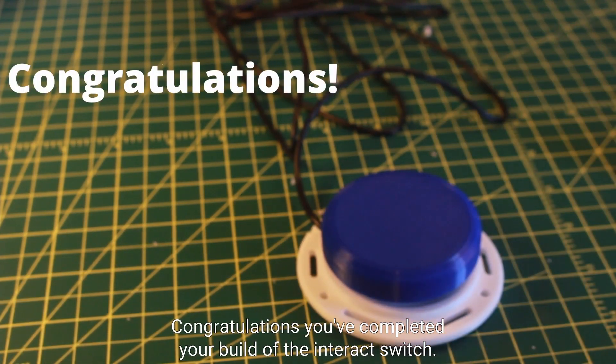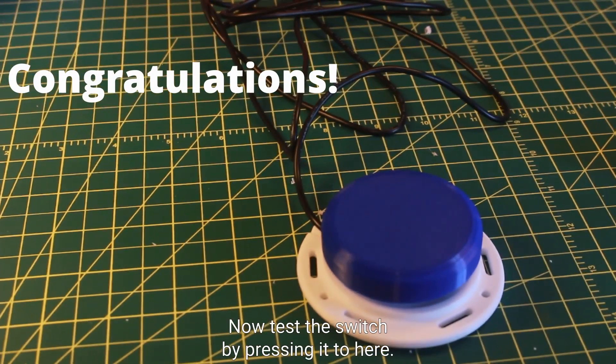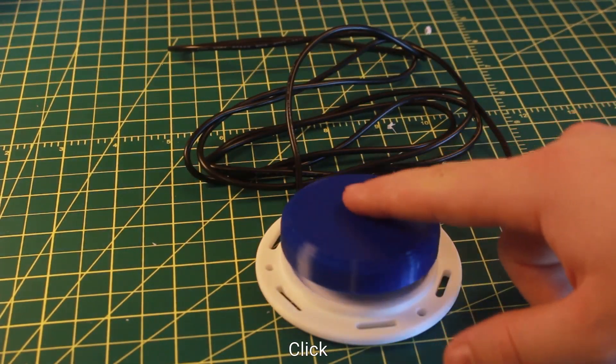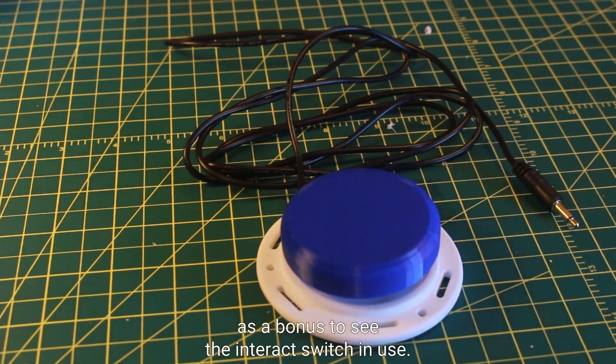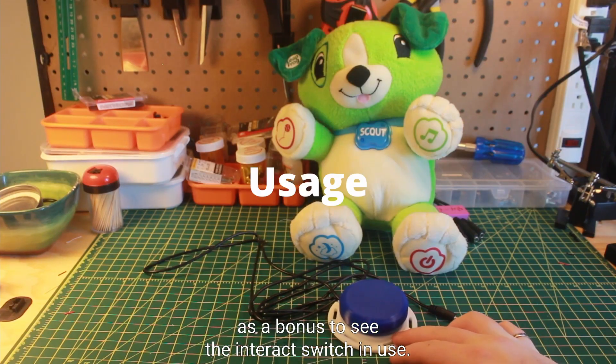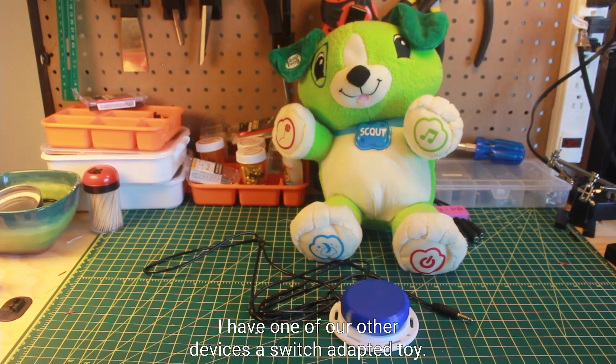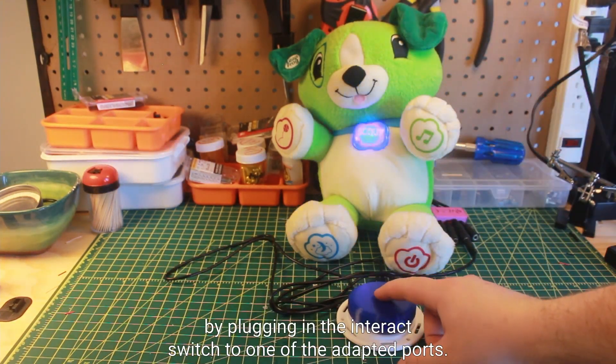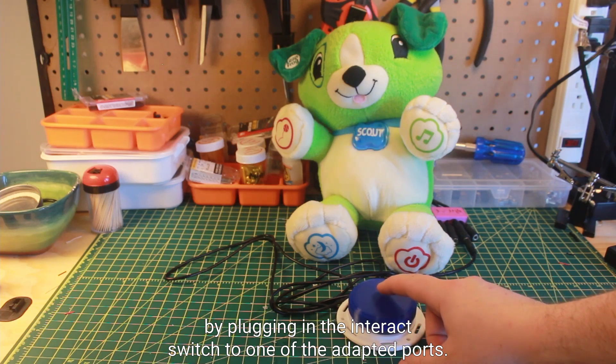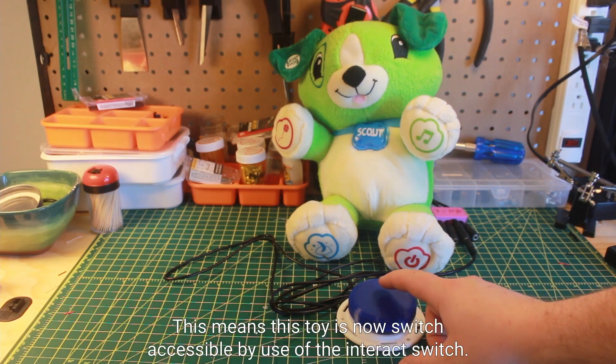Congratulations, you've completed your build of the Interact Switch. Now test the switch by pressing it to hear it click. As a bonus to see the Interact Switch in use, I have one of our other devices, a switch adapted toy. The adaptive toy can be controlled by plugging in the Interact Switch to one of the adapted ports. Now this means this toy is now switch accessible by use of the Interact Switch.